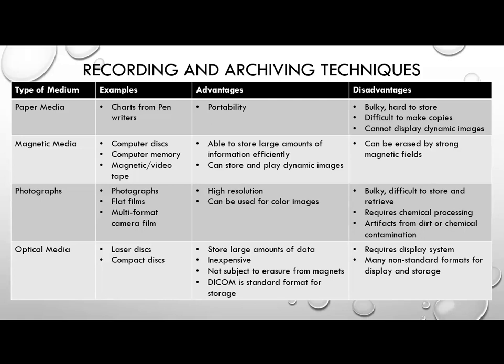Optical media has been used, and these are laser discs or compact discs. This is typically what PACS uses. You can store large amounts of data. It's inexpensive. It cannot be erased by magnets. Usually we utilize DICOM to store the information. But this requires its own display system.